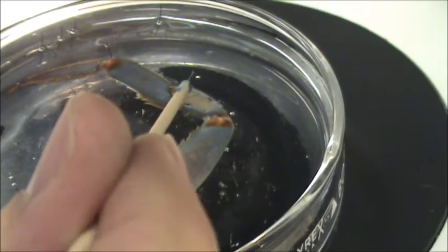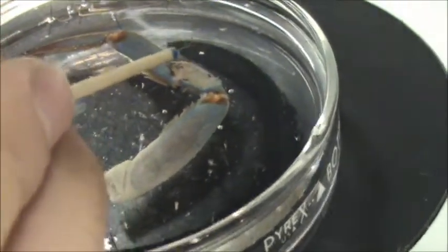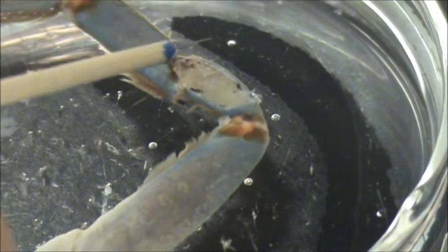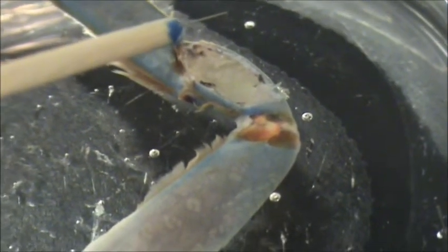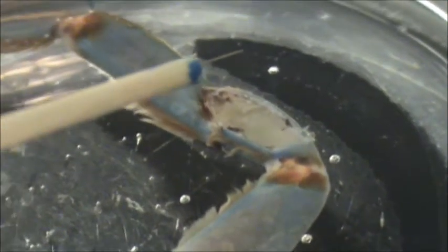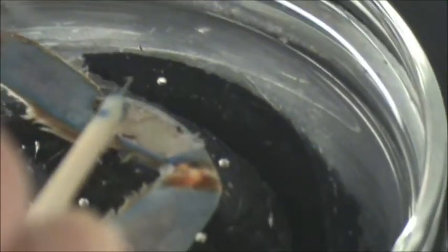Then now we are going to try to find the motor nerve here. Like I said, you can try first to see if you can find it, but later on we will stain it with methylene blue. Then you can know the location of the motor neuron here. Then later on you can find it easily without staining. But you can use this simple tool to find the motor nerve.